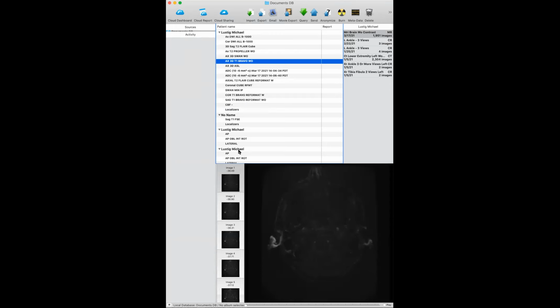So you do some preparation, an inversion pulse at 180, and then they wait a little bit till the contrast between gray and white matter increases, and then they perform a few encodes, and then they repeat the preparation and perform more encodes. So that gives you good T1 contrast.